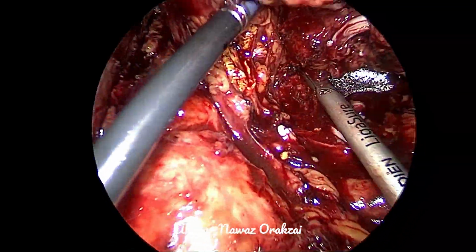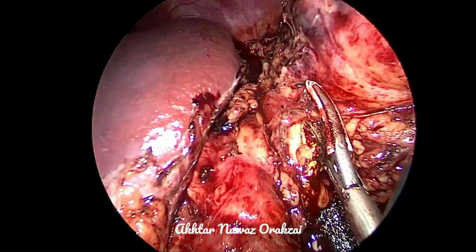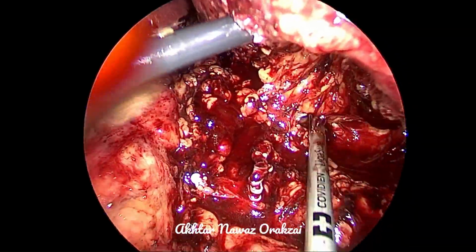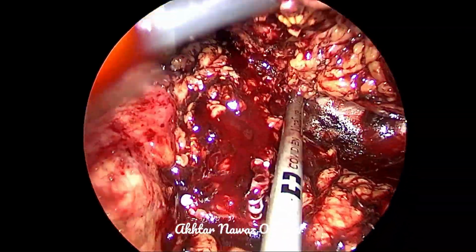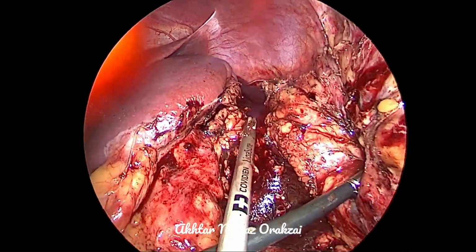And now again, after doing the hilum, we dissect the kidney. We are moving more towards the kidney rather than medially, because the pancreatic tail may be injured.